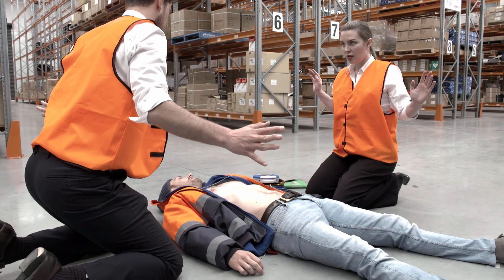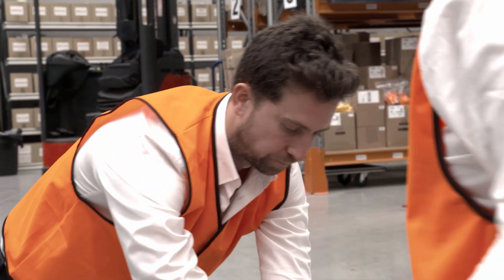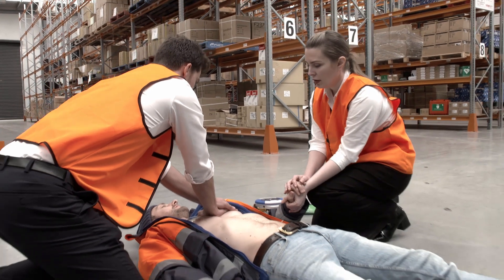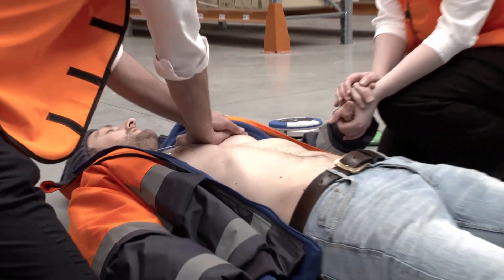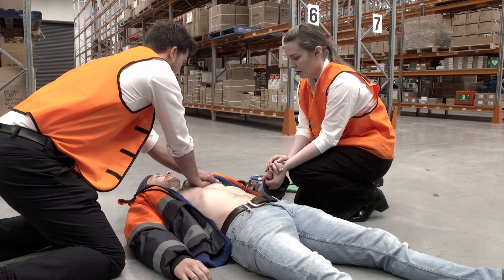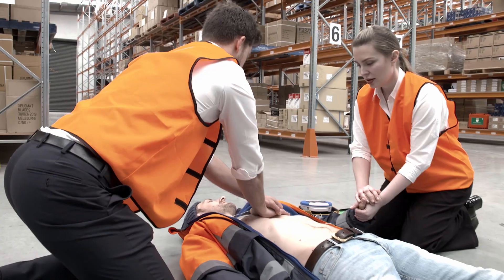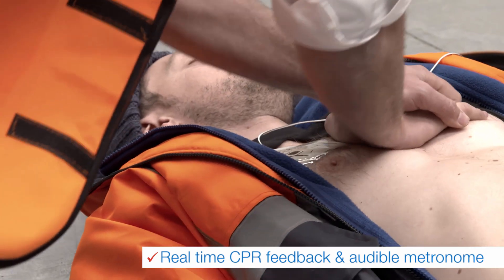The 500P will inform you when it is safe to touch the patient and prompt you to begin CPR. The 500P has an inbuilt metronome and provides real-time CPR feedback to ensure even untrained first responders provide the best possible assistance. The 500P will tell you where to place your hands and the force and rate of compression in time with the metronome. Begin CPR. Push slower. Good compressions.